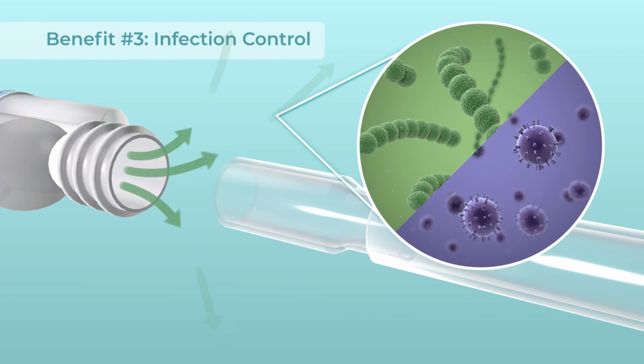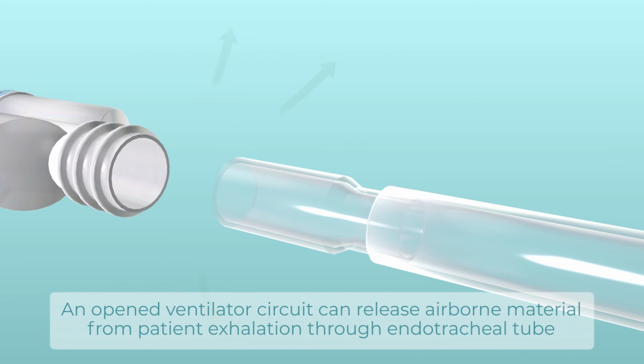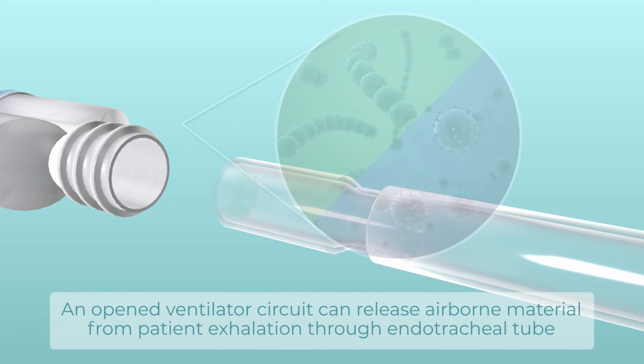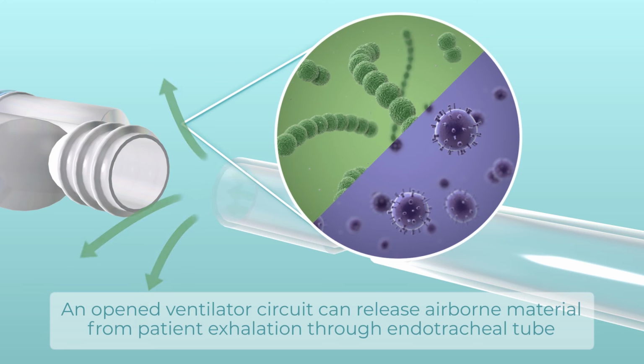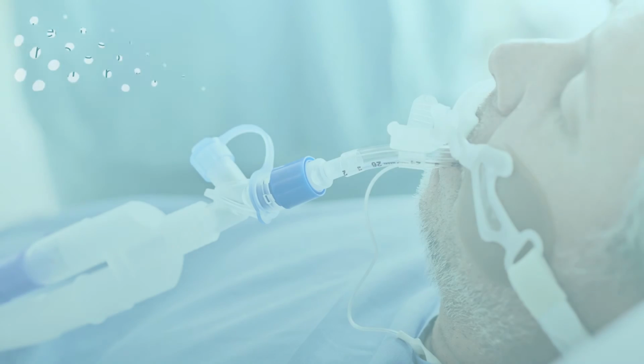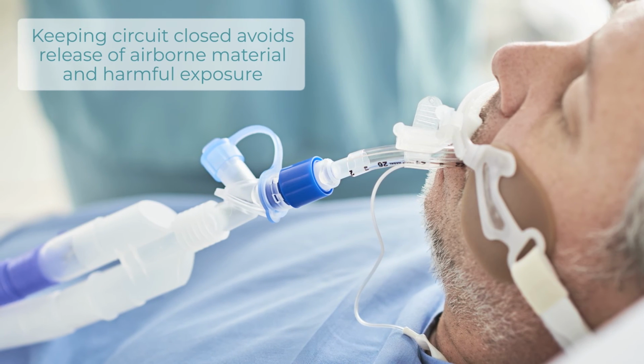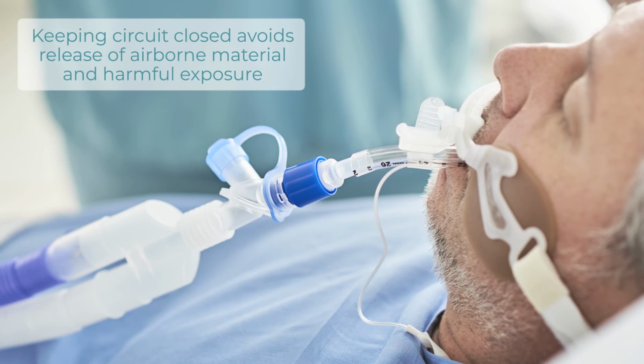Infection control is also addressed by Fluso. Upon disconnection, patients will passively exhale through the endotracheal tube, resulting in further infectious airborne material. Keeping the circuit closed avoids both of these scenarios and protects the healthcare team from exposure.